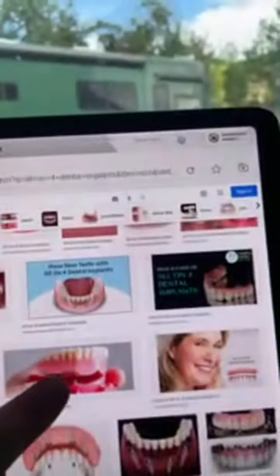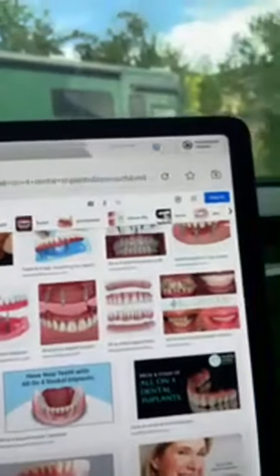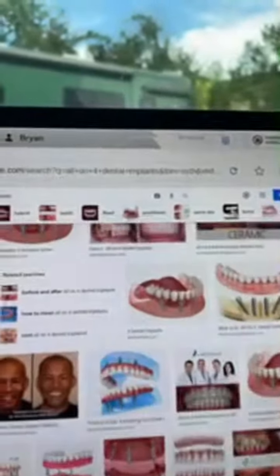Secondly, it would have to have the inside of the mouth, so the top of your mouth would be lined a lot of times, not always, but because it's bulkier, now you're going to deal with speech issues. It's not to say that you can't work them out, but it's a little bit harder to get used to.